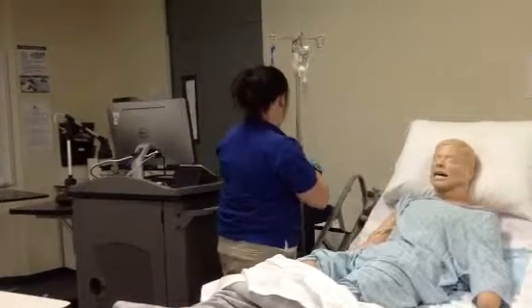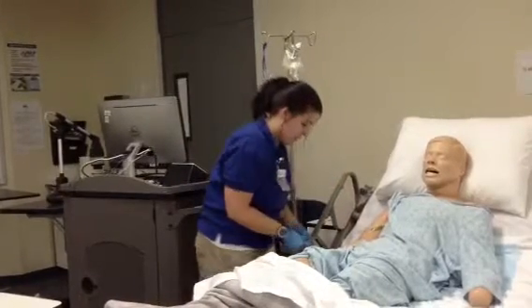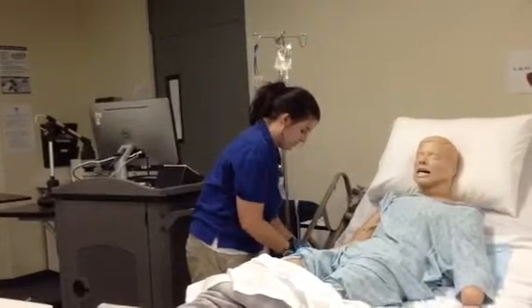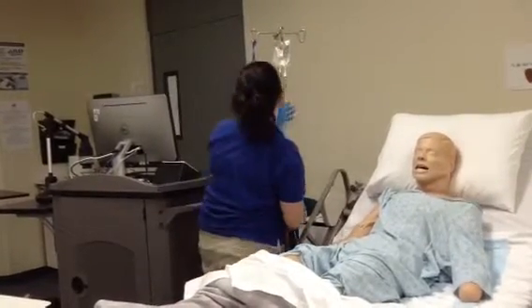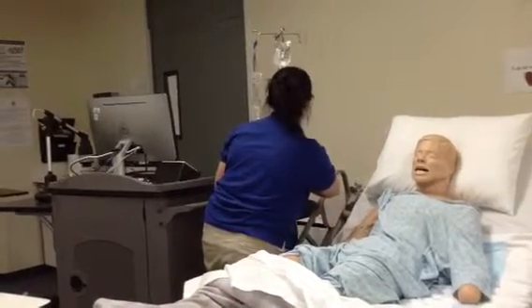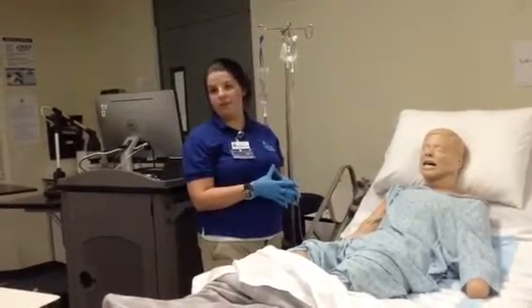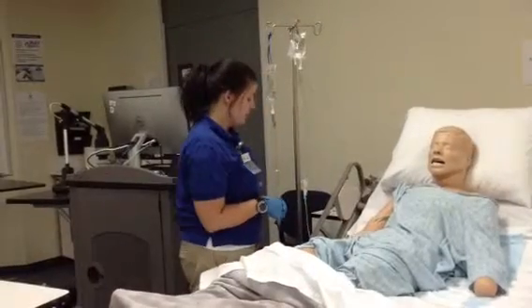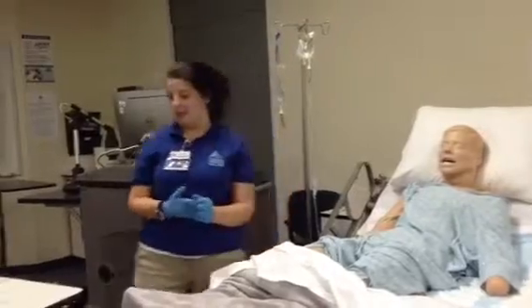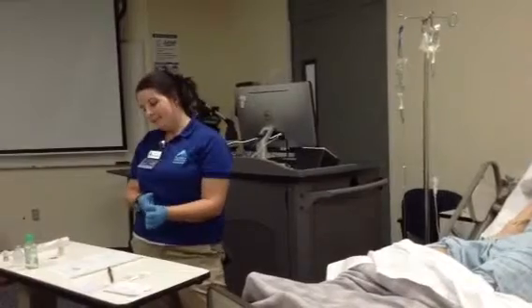I need to check it's still clamped and then check my drops per minute. Connect it before I do that. Okay, that's connected. Check my drops per minute and my clamping. Okay, perfect. And it's at 17 drops per minute, like I said that I calculated in the beginning. So that's good. Check that site once again. You feeling okay, Mr. Jackson? All right, good. Okay, so now that's running. It's going to run for 30 minutes.